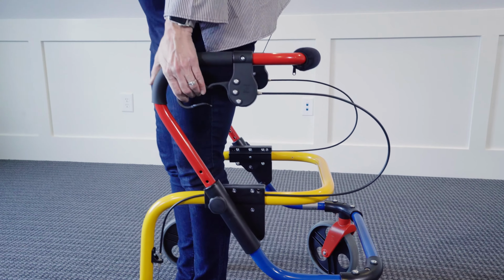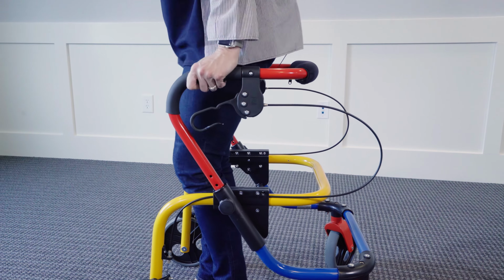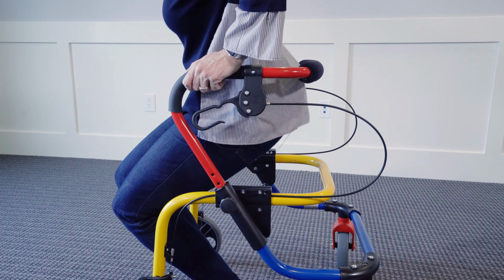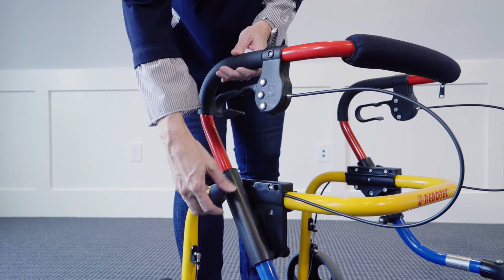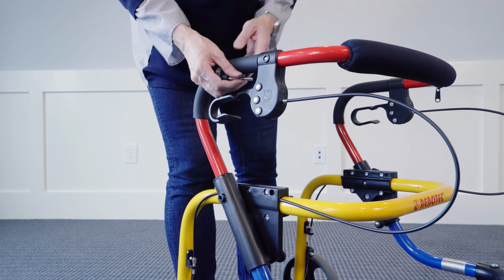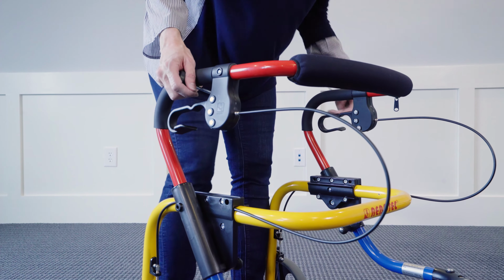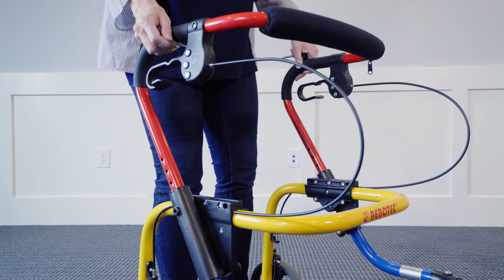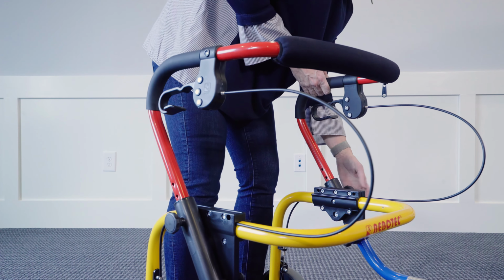About the brakes, you can actually lock them down so your walker won't roll while you sit down in your seat. That's a nice function. The whole upper frame can adjust with a toolless knob. You pull it out and this will adjust the whole top frame of the walker for the height. So you just pull that out and you can slide it up for the height you need. Simple enough. And just do the other one, same thing.